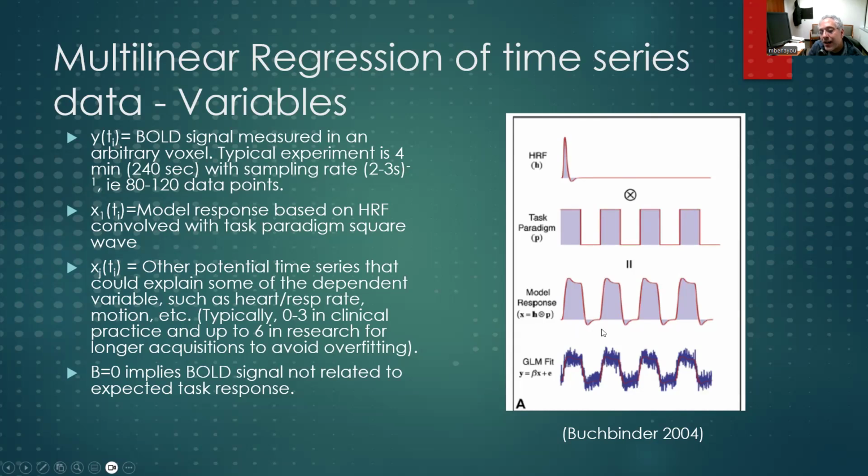you would predict that a voxel in the brain that really was changing its bold signal with the task paradigm would have a time series that looked like this one here. It would kind of go up, have a little bit of a dip because of the dip in the impulse response, and then with a little bit of lag because of the non-instantaneous response to the stimulus, when the task stopped and they moved to the control phase, would sort of quickly diminish and might undershoot just like the response function would, and then come back and then alternate again back and forth between task and control. And so this is a really good example of the expected bold signal in a voxel in the brain that is associated with the task the patient's performing during these intervals.